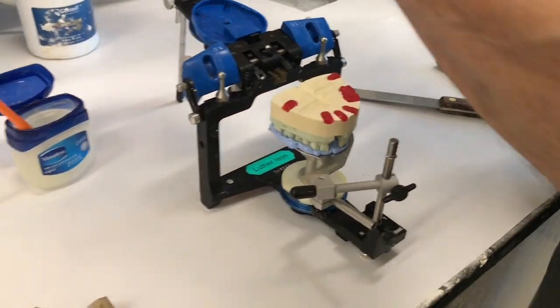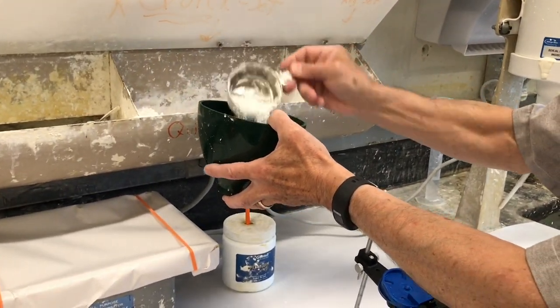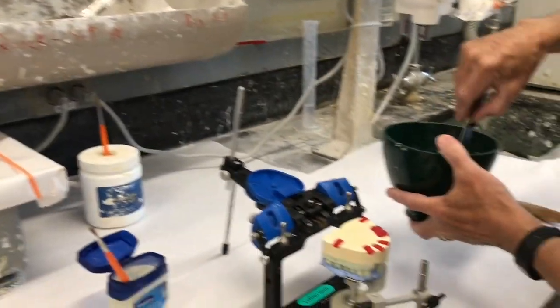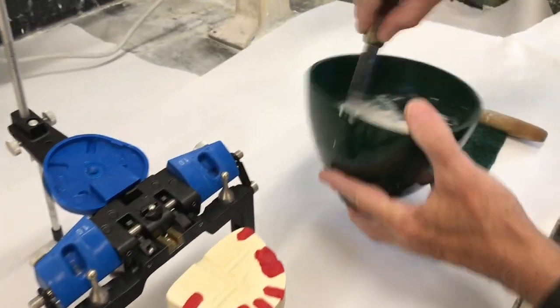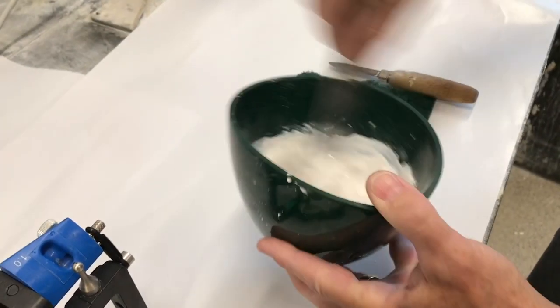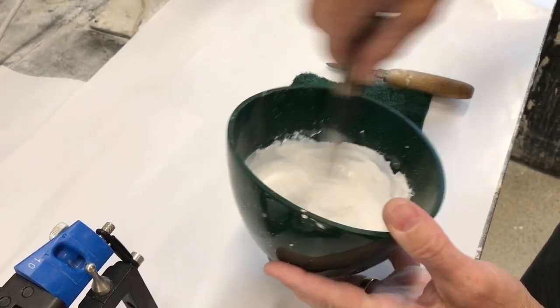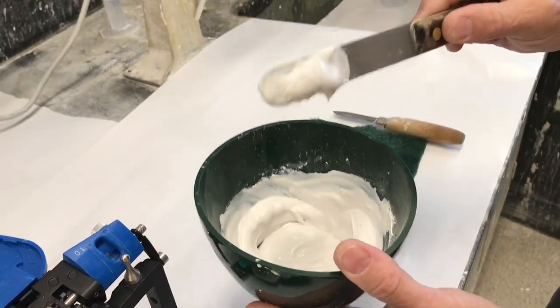I've got water in the bowl. I'm going to use a little bit of Kwik-Set plaster. I'm not measuring out — I know the consistency I want. With Kwik-Set, it can be a little bit runny. Make sure I've got a good mix. The consistency is about like that. That's right where I want it.